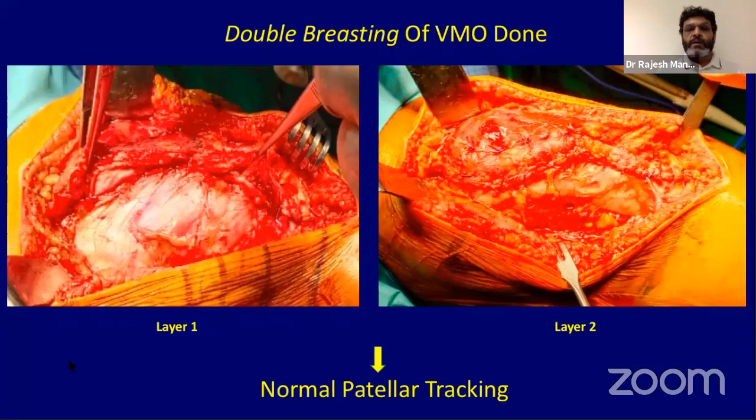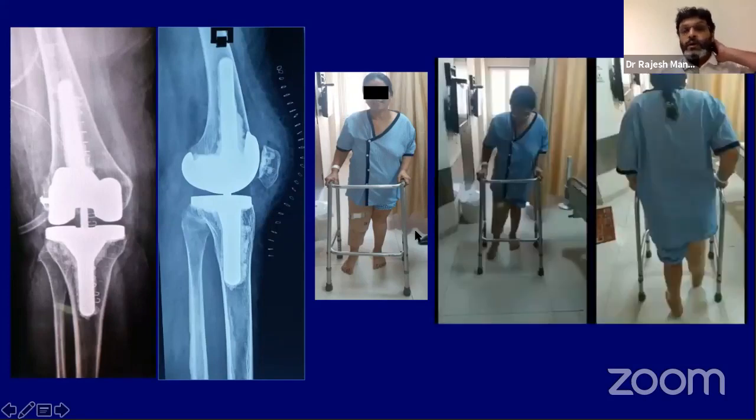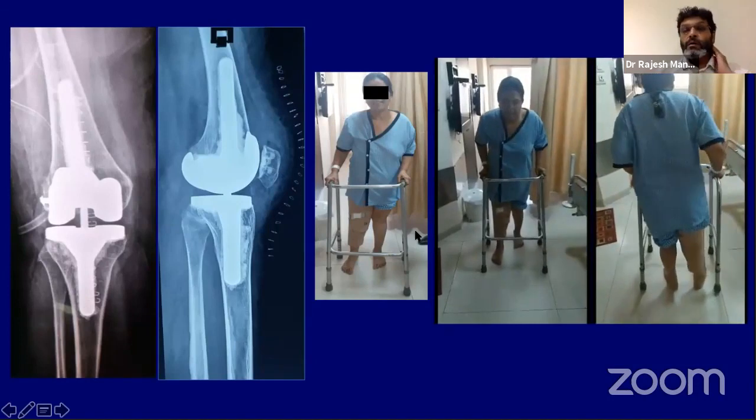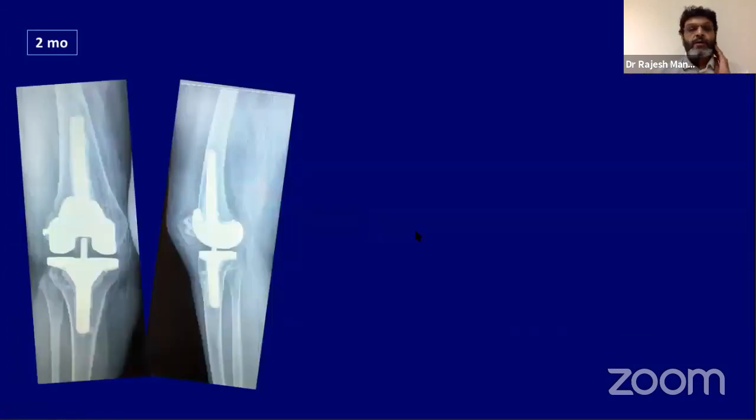Double breasting, and here is the patient. You can see immediate post-op, the patella is now sitting right in the front. Good correction, that's the osteotomy. Patient, of course, mobilizing using a brace and a support.